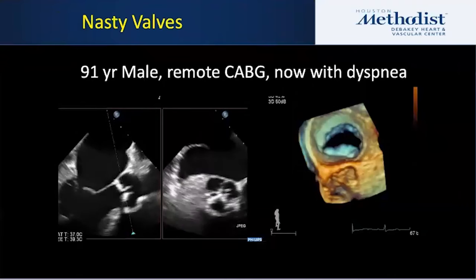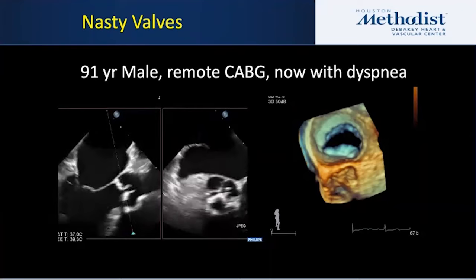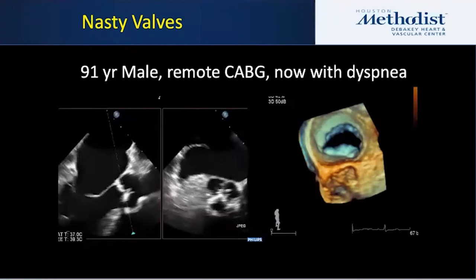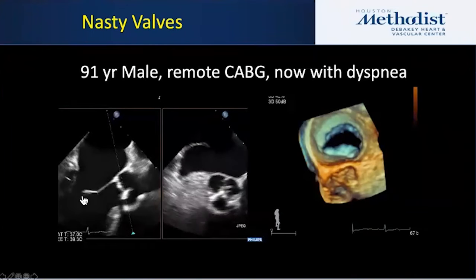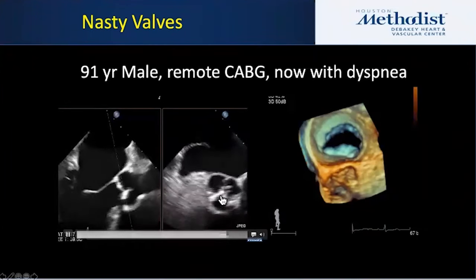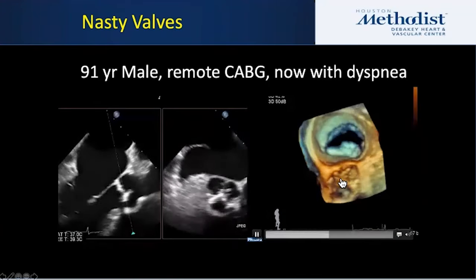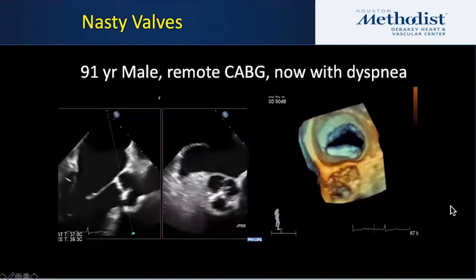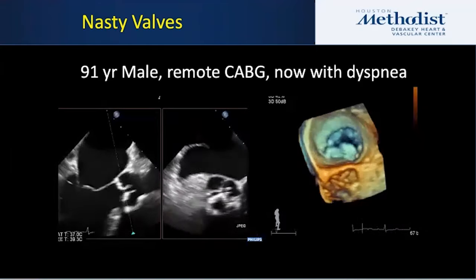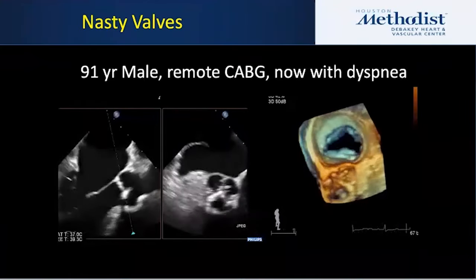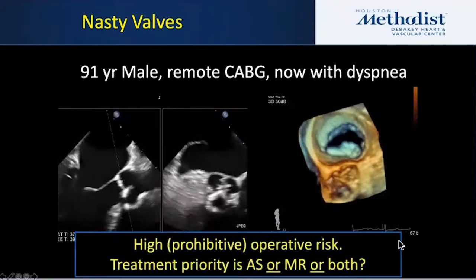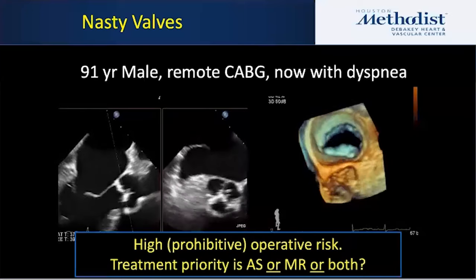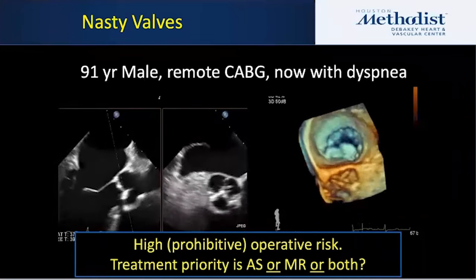Here's an example of two bad guys. This is a 91-year-old who presented with dyspnea. He had a history of remote CABG. From the 2D images, you see a couple of bad things: a mitral valve that doesn't close and an aortic valve that doesn't open. That's a bad combination. It's a pretty picture in 3D — not new information — but it tells you you've got a double valve disease that is significant.